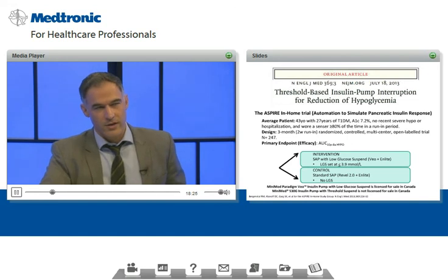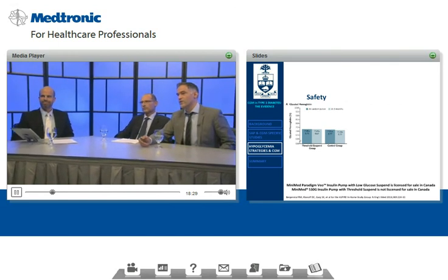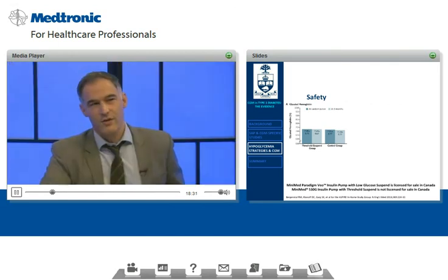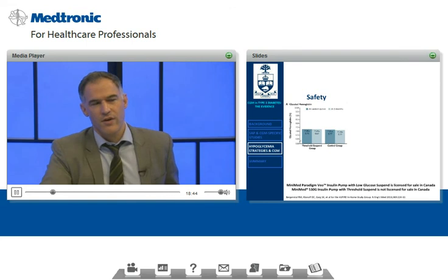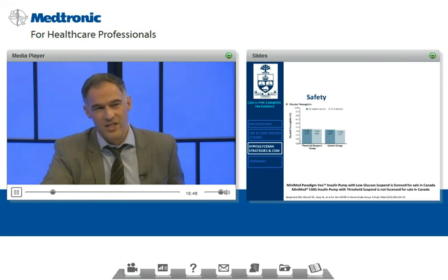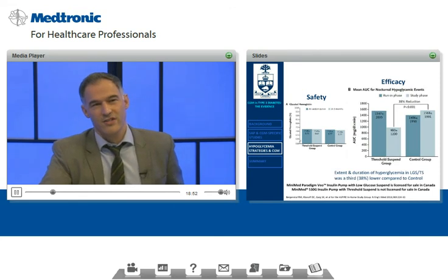All right, I think I described that study well enough, probably a little too much. So let's get on to results. The first outcome was a safety outcome, and this is, to me, beautiful. A1C was the measure of safety. In other words, if you're going to shut off someone's basal now and then, are you going to mess up their overall glycemic control? And the answer is no. They had very stable trends towards little decreases in A1C over 3 months. But the key thing is the area under the curve, the efficacy measure.